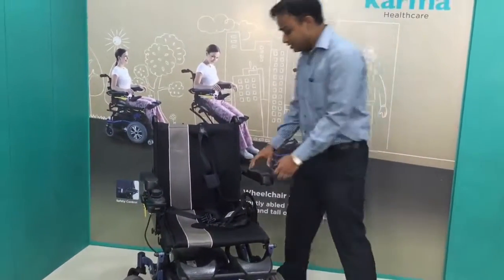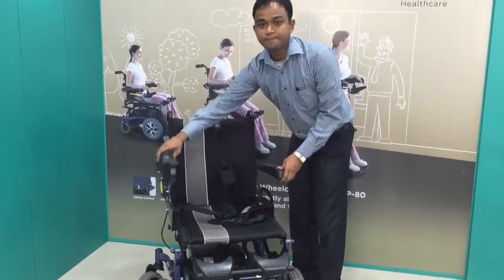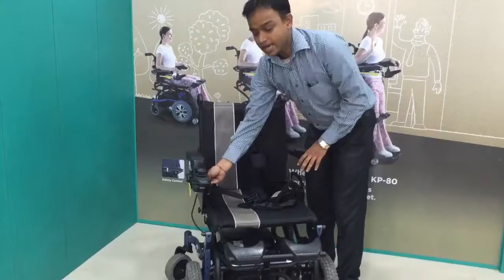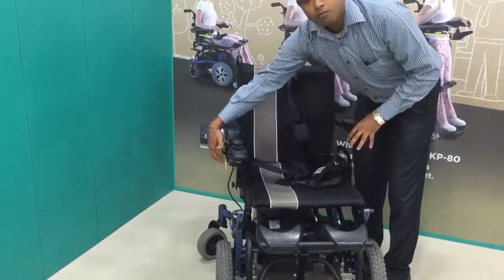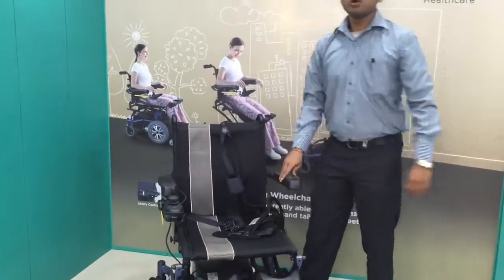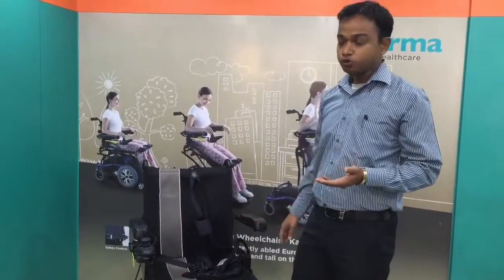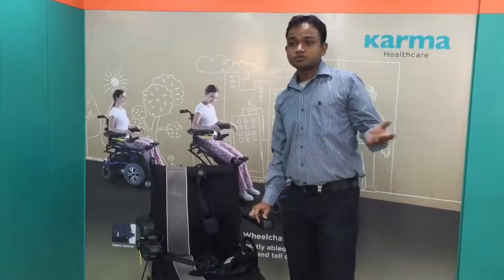Apart from that, these two armrests are split-back and the joystick also swings away. Due to that, you get more space so you can reach any space like a bookshelf or store.